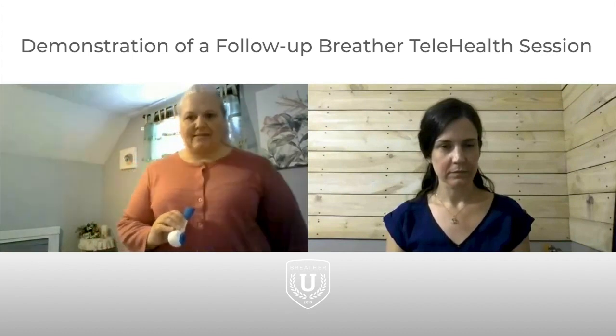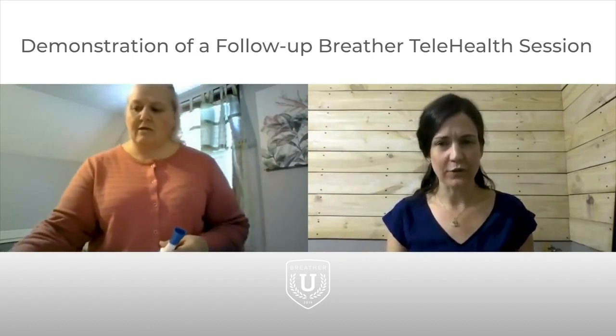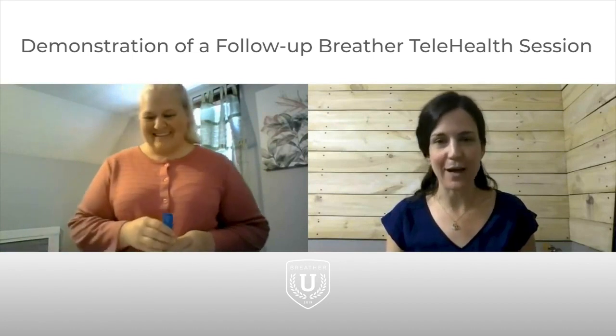Okay. Do you need to wait a little bit longer? All right. I think I can try. Okay. I'm going to ask you to try 5. If you get to 5 and you're like, I can do it, I'm going to keep going, that's fine. But again, the way before, you couldn't quite do 10 at first, that's fine. If you're doing 5 for a day or 2 and then you can do 7, that's fine. So let me see how you feel. Or if you do 2 and you're like, you're crazy, lady, then just stop and tell me.